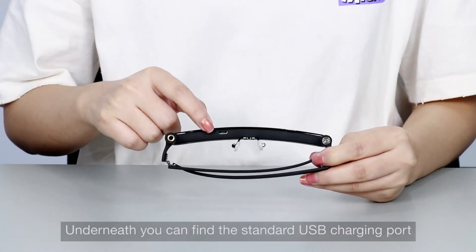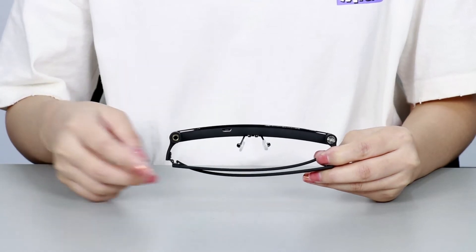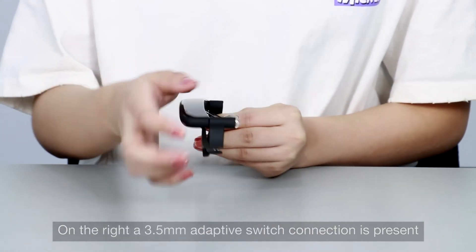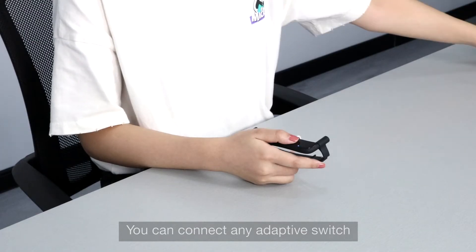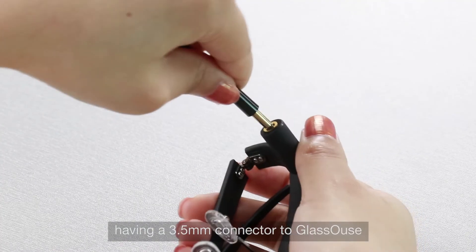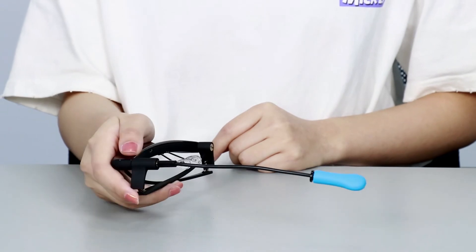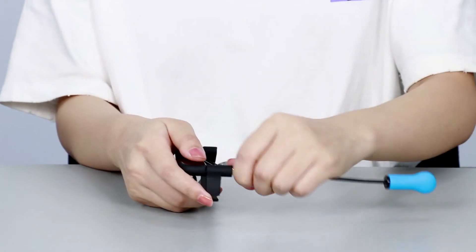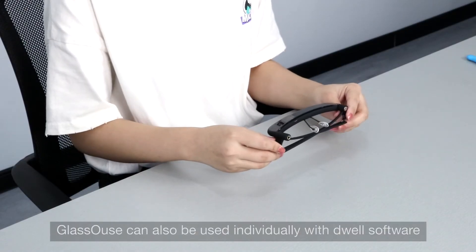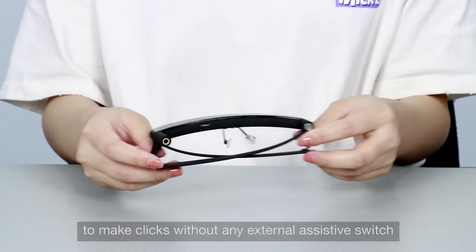Underneath, you can find the standard USB charging port. On the right, a 3.5mm adaptive switch connection is present. You can connect any adaptive switch having a 3.5mm connector to Glasshouse to make a click while operating your device. Glasshouse can also be used individually with Dwell software to make clicks without any external assistive switch.